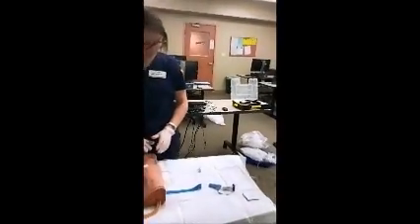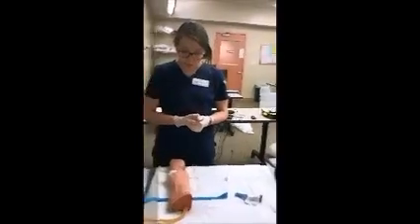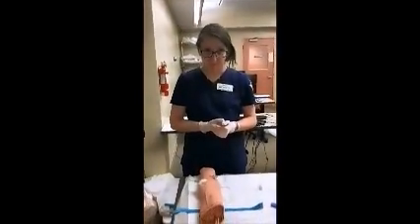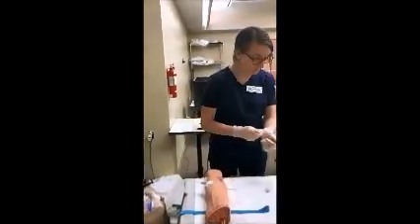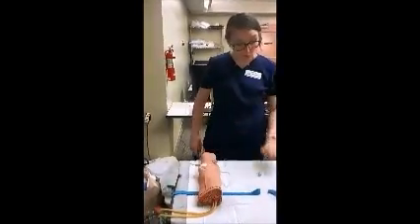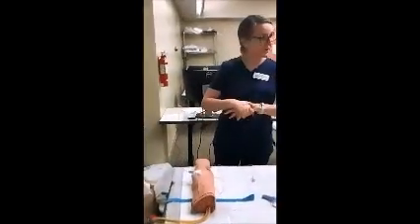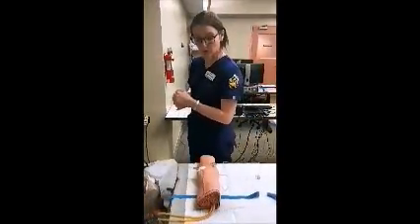Okay. So now that that's taped really good, we'll check on Joe. Joe, do you need anything else while I'm in here? Nope. Okay, sounds good. Well, I'll lower your bed down here so you're comfortable. Make sure your side rails are up so you don't tumble out when you're wiggling around on me. Perform some hand hygiene, and if you don't mind, I'm just going to sit here. I'm going to document what we just did, okay?